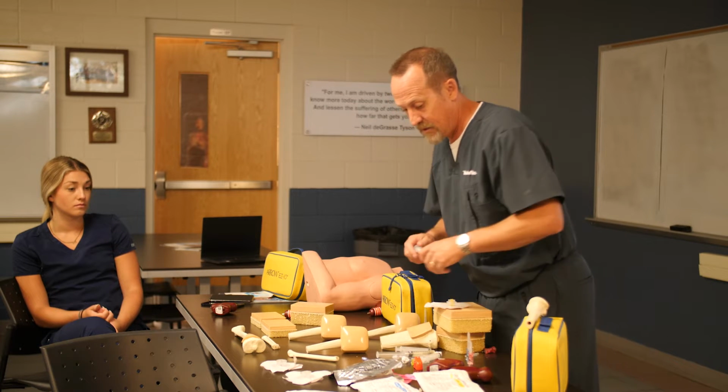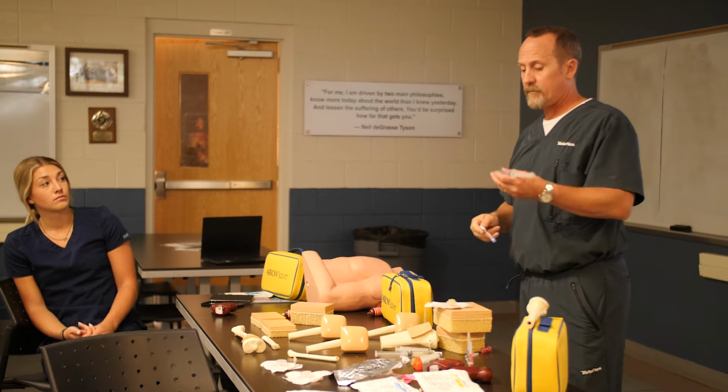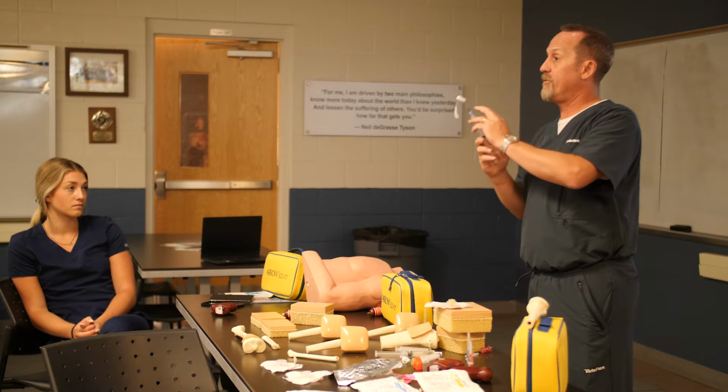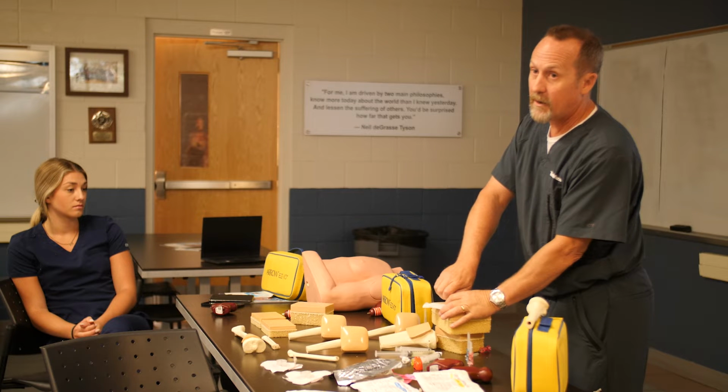Once we've done that, we're gonna get our little extension set that also comes in your kit. Hook that to a sterile saline flush. Be sure and prime it before you attach it to the device. And now we can hook it right up to the hub.